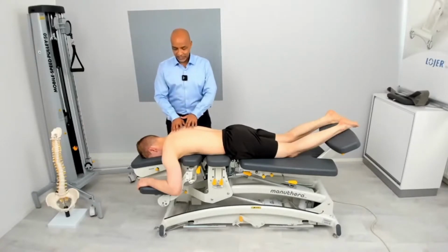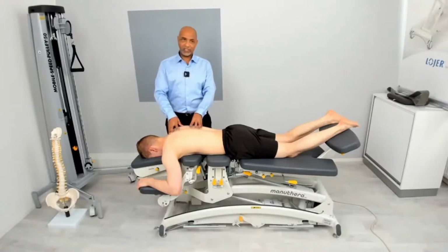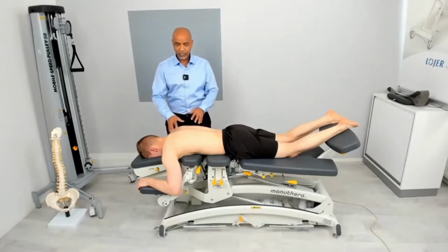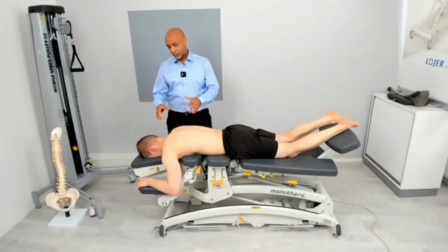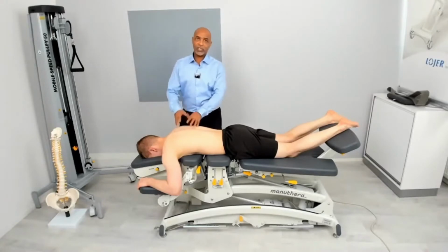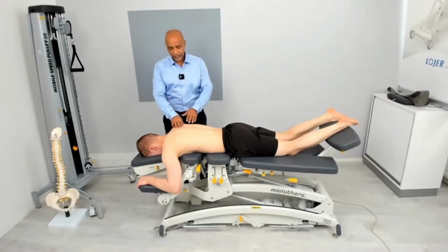Luckily and gratefully, Manuthera 242 is the only treatment in the world which covers the mobilization or the mobility of the upper thorax. The majority of treatment tables are static, and hardly any will help and assist in opening up the rib cage movements. Now, how are we going to demonstrate that?